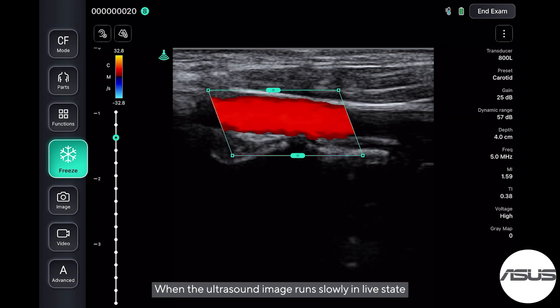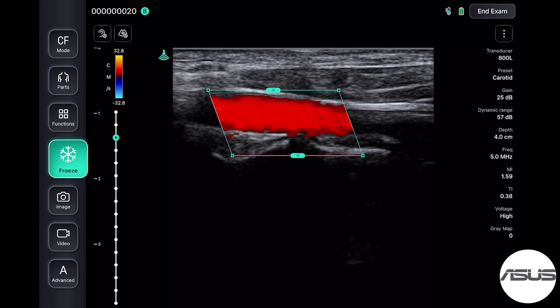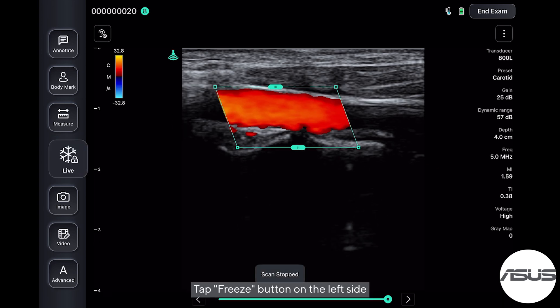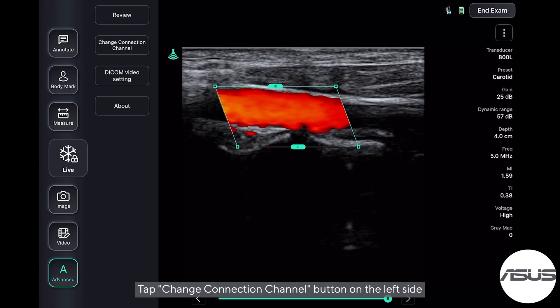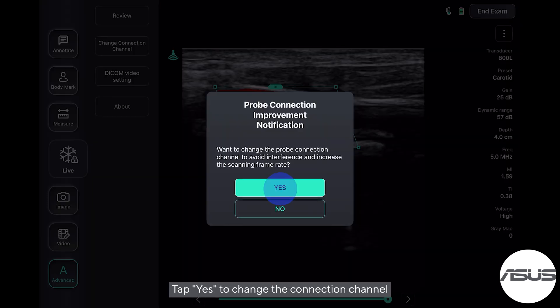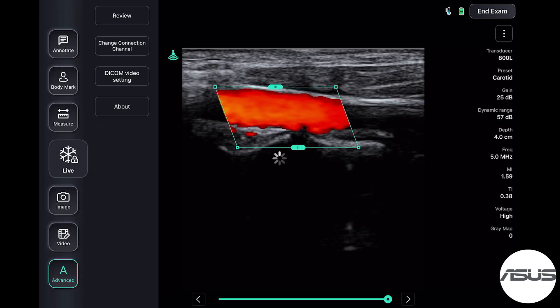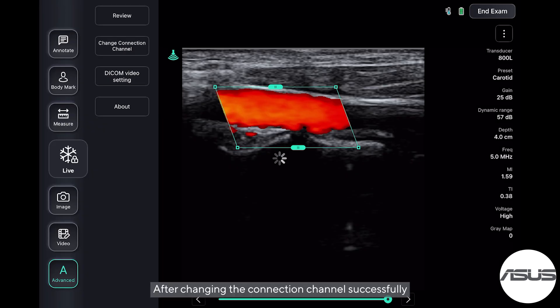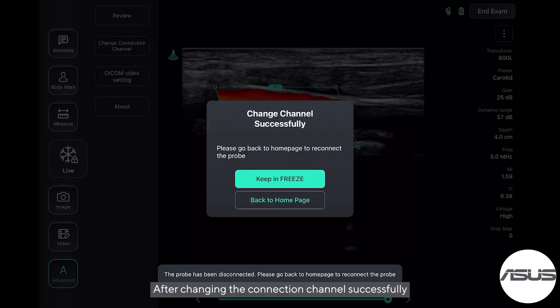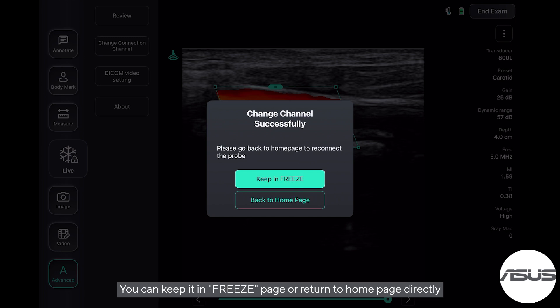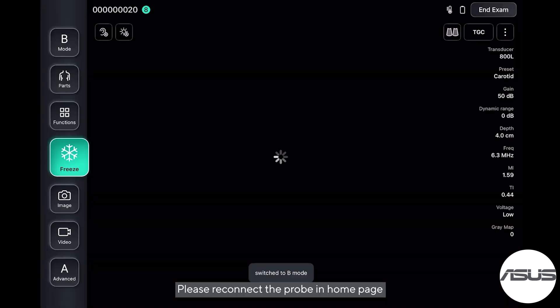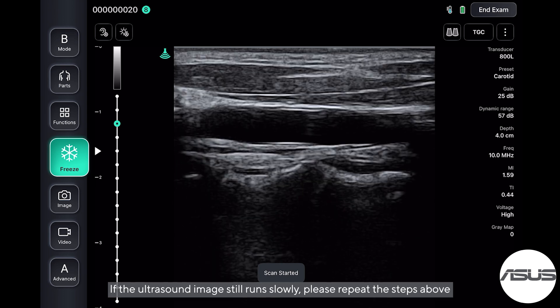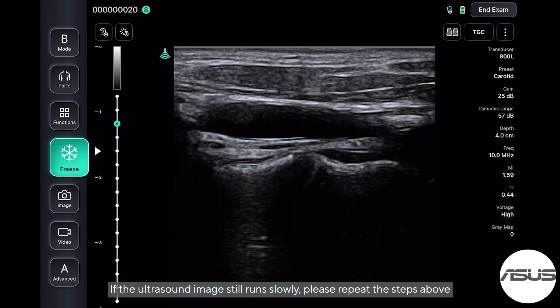When the ultrasound image runs slowly in live state, tap the Freeze button on the left side. Tap the Advanced button, then tap the Change Connection Channel button on the left side. Tap Yes to change the connection channel. After changing the connection channel successfully, you can keep it in freeze page or return to the home page. Please reconnect the probe in the home page. If the ultrasound image still runs slowly, please repeat the steps above.